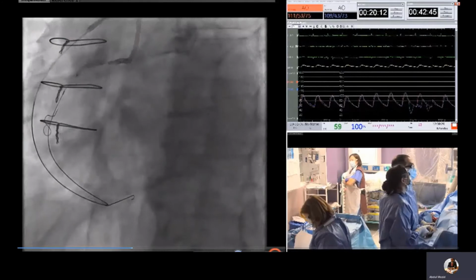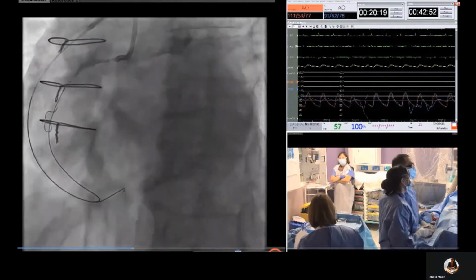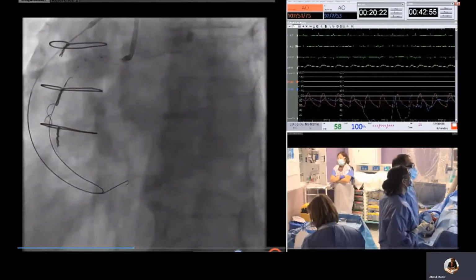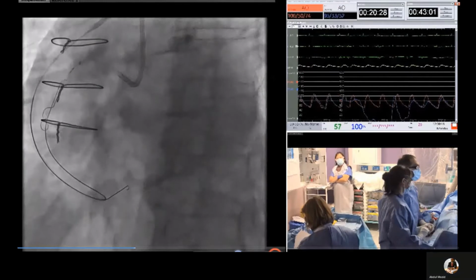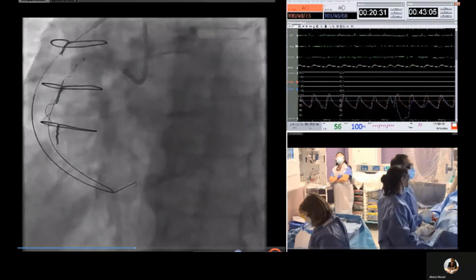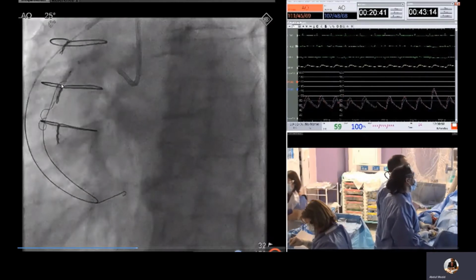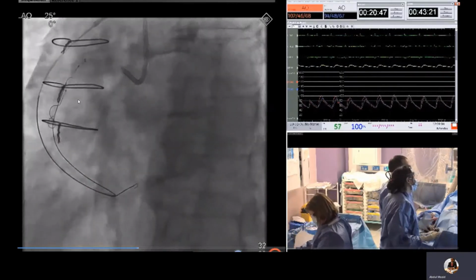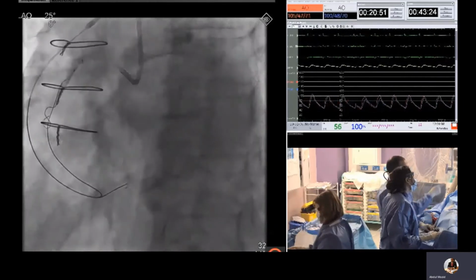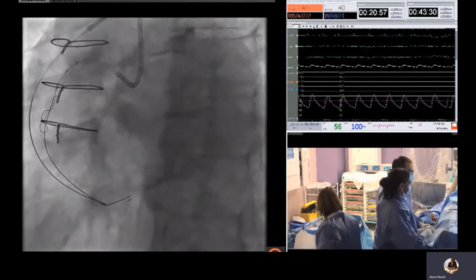We inflate the proximal tract to allow delivery of the guide extension catheter. And this is the inchworming technique, where the guide extension catheter is advanced over an inflated balloon. You see this. So this is a very good, nice sign when you can see movement of the wire and microcatheter on balloon inflation. As you'll see here, this tells you that you are in the same space and essentially connected.